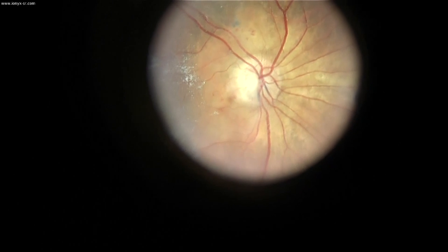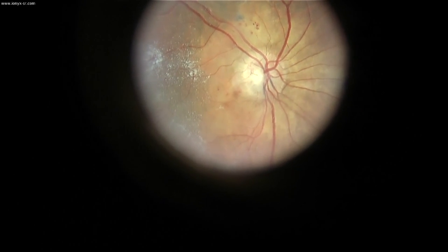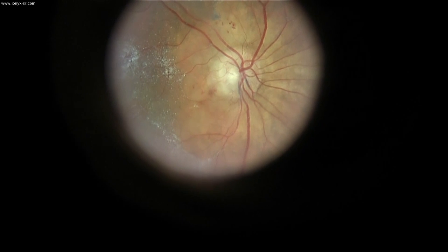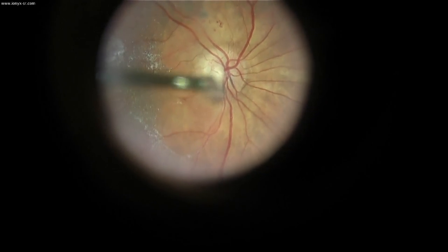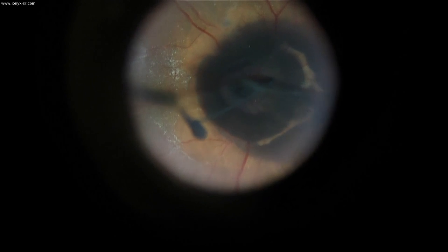Hello? I am staining, I don't know if you heard, I am staining and peeling the ILM around the papilla, as you suggested. Can you see the images in the video?